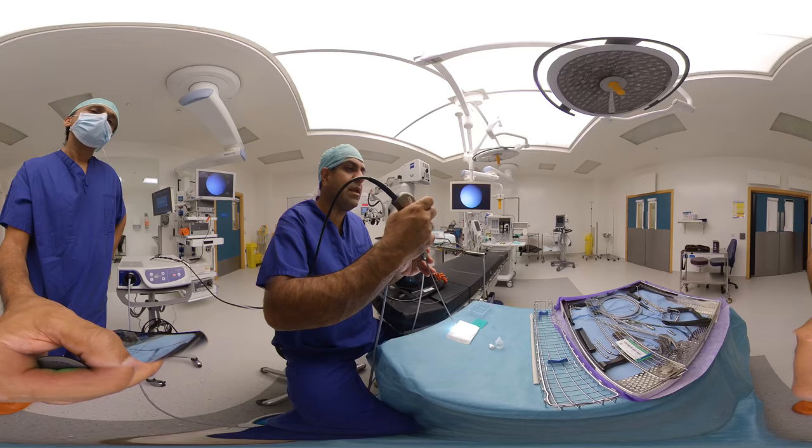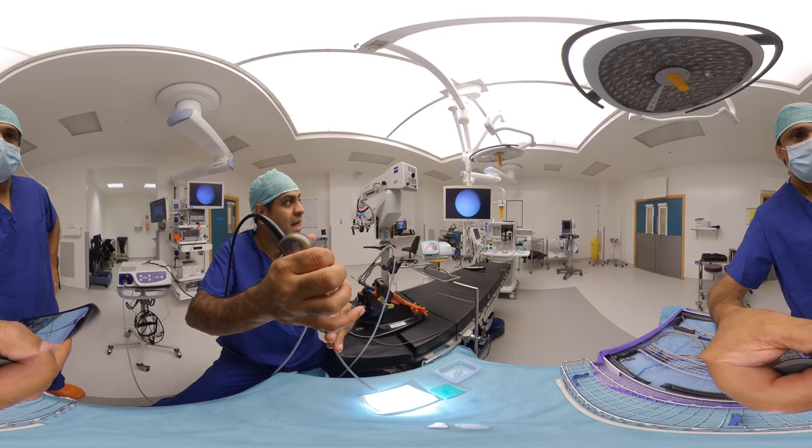What we also can do is white balance. On the top of this camera there are three buttons. The middle button gives you a menu — go down to white balance, and you white balance by pressing the middle button again.